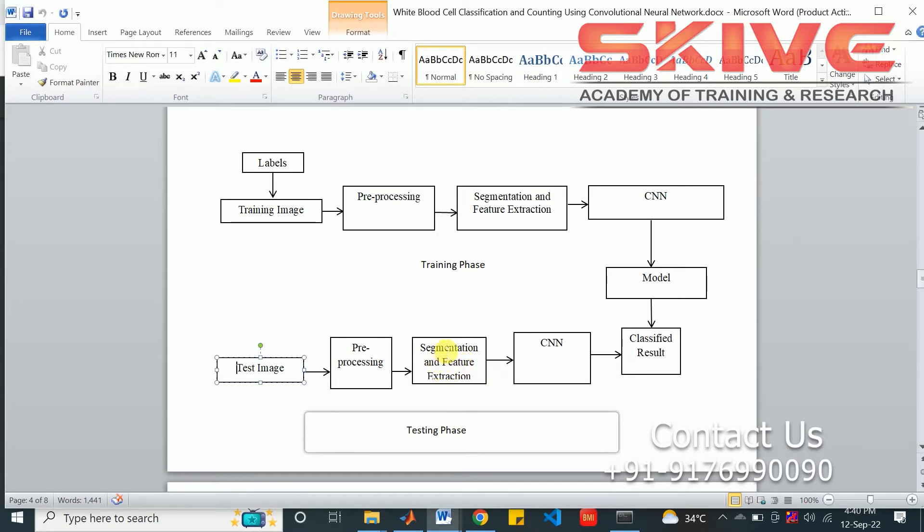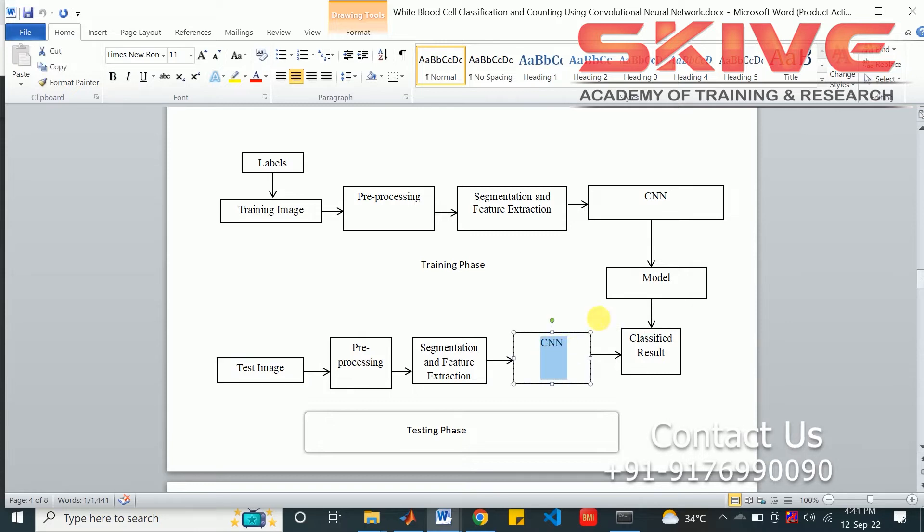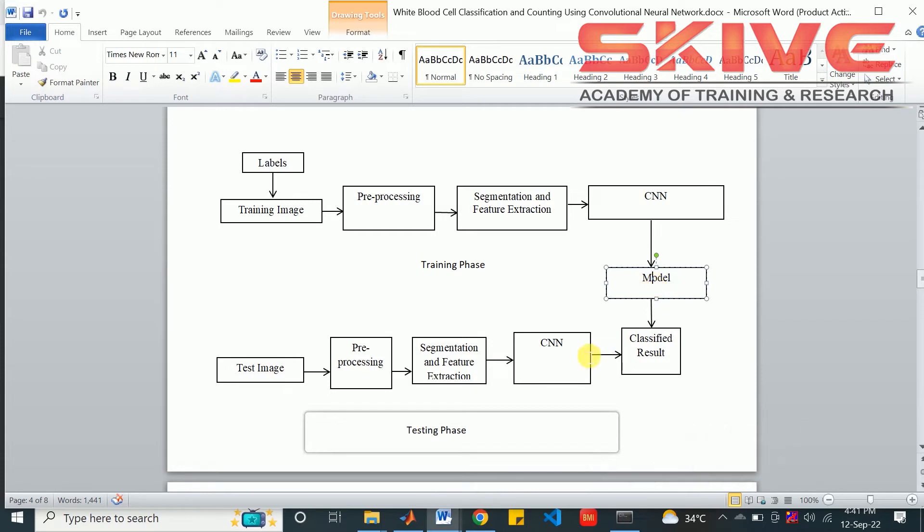After that, feature extraction will happen. Then the network will be used for comparing the model, predict the result with the model, and the CNN result from the test image.